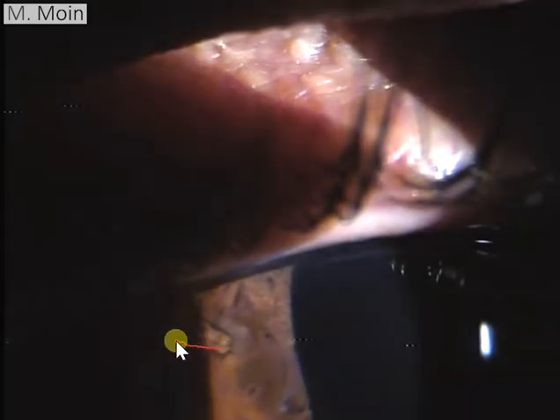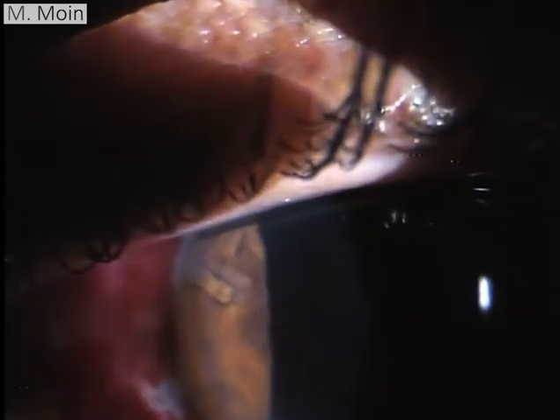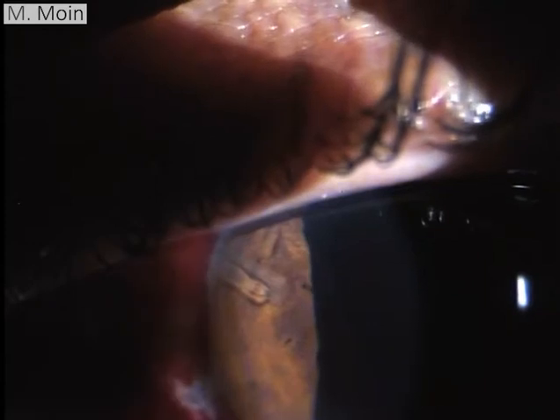Here you can see this is the AGV valve which is visible over here, the tube which is coming into the anterior chamber. This is the front part of the tube, and we'll show you all parts of the tube going through the video. What you want to see, the anterior chamber is deep and well formed, and the tube is present.